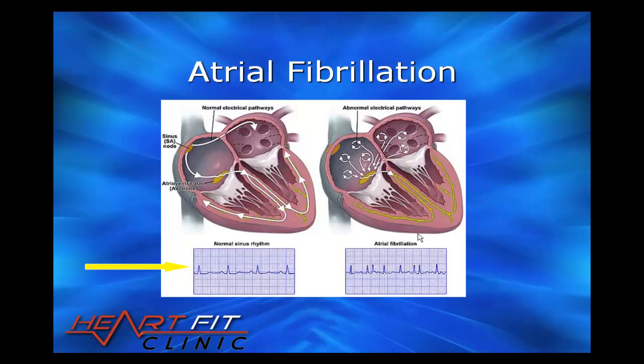You can see a nice P wave, a QRS complex, and then a T wave. And you can see that very well documented here as a P wave, QRS complex, and a T wave. And you can see that happening very regularly.